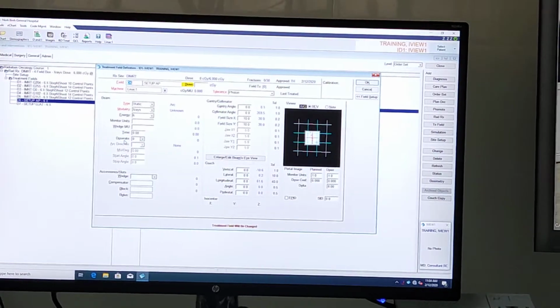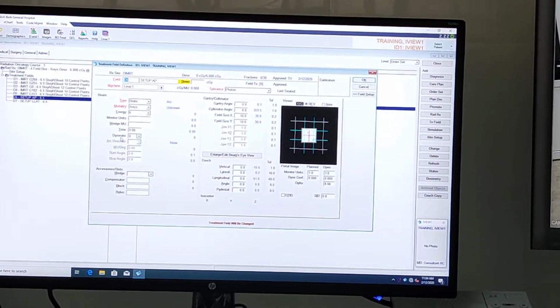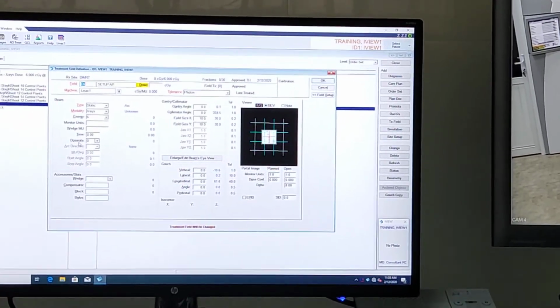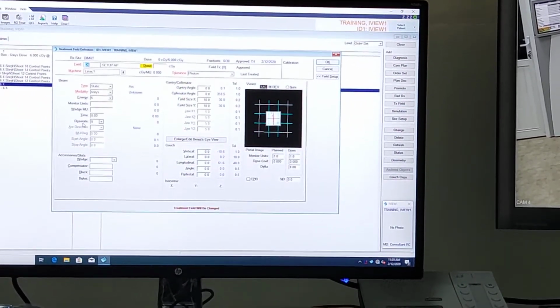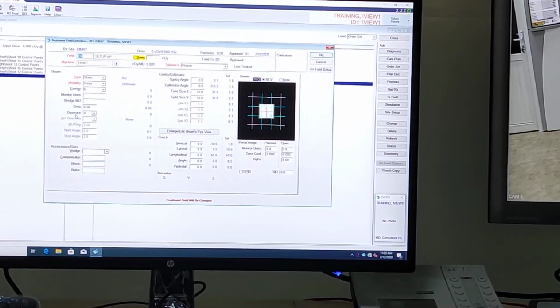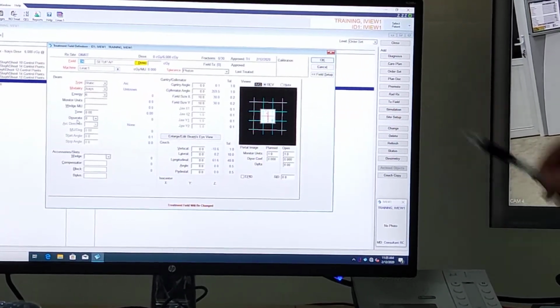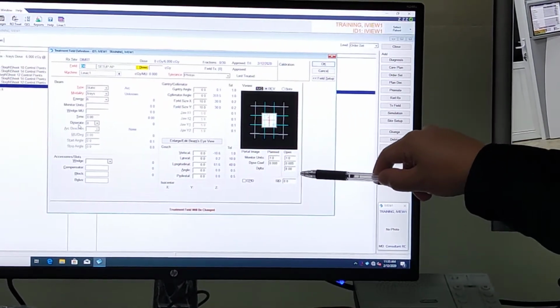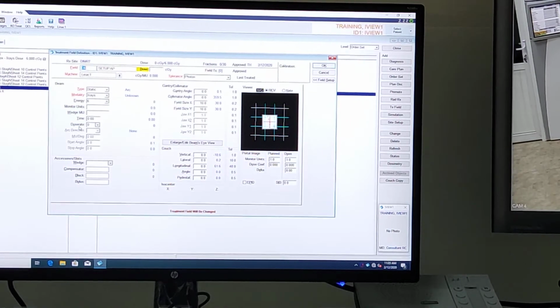You use that. So for example, here I have plan field 10 by 10. If I want to use double exposure, I expose a second time larger field. The field size of the larger field will be 10 plus 8. So my open field will be 18 by 18.